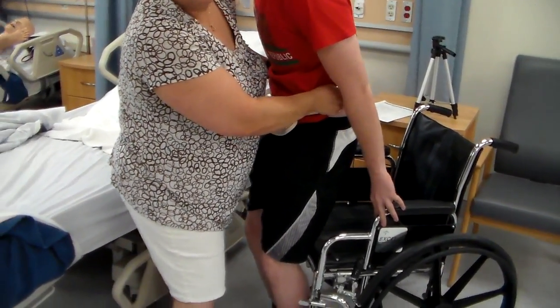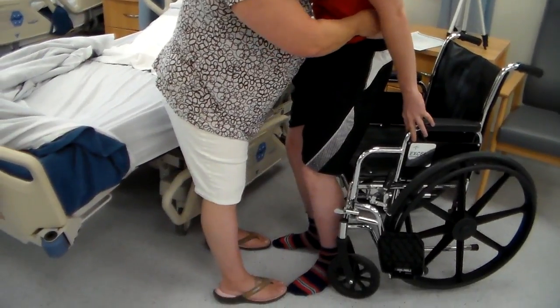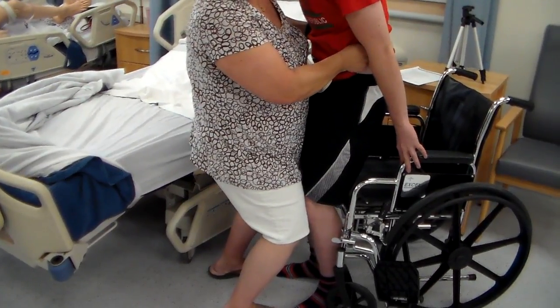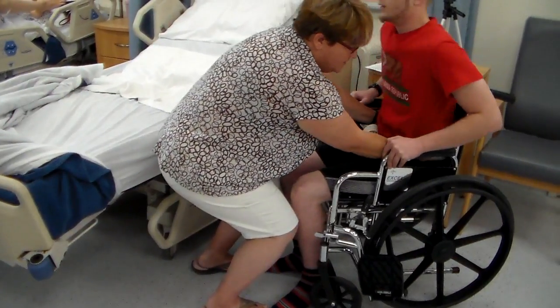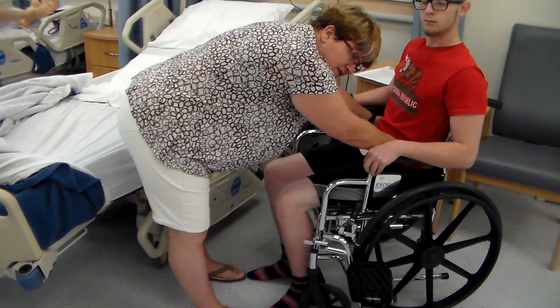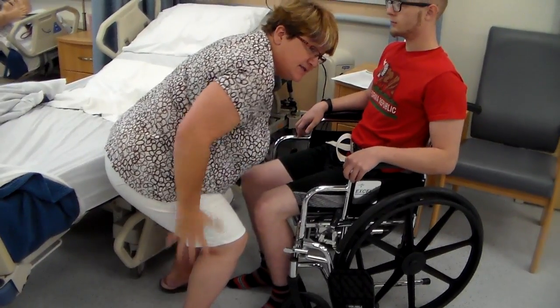Now, I'm going to put my feet here down by his again to make sure he doesn't fall. What could happen is I could also put my thighs into his knees, okay, and help as well. Okay, ready? 1, 2, 3. See how low I got, people? Okay, you don't want to be like this. This is not how I want to be with assisting somebody. It's low. You're going to get low. You're going to use this.